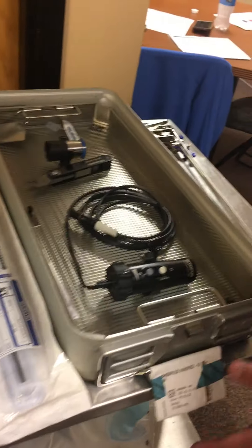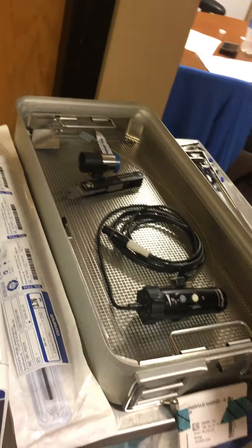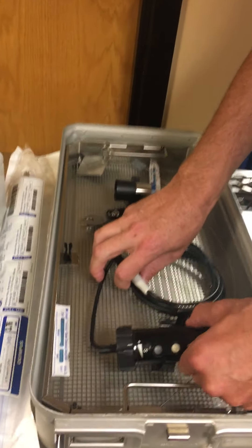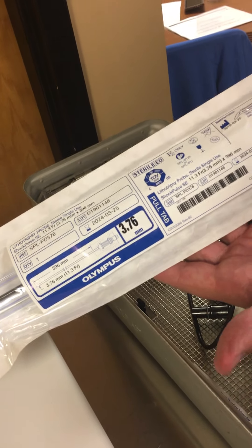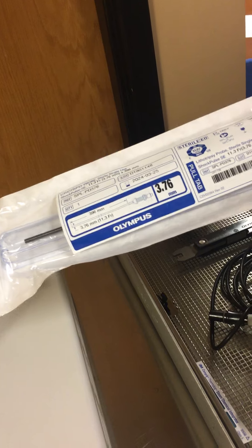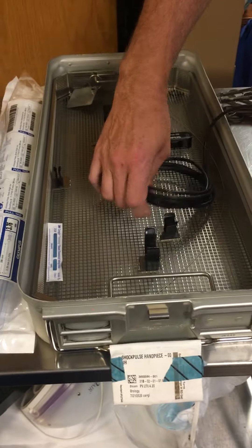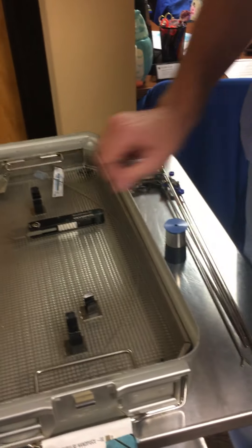Our ShockPulse is ready to use at this point. We'll attach the probe and the transducer. This is our ShockPulse handpiece tray — we have three of these trays. Each tray contains our transducer, our wrench, our nose cone, and then the sterile probe. The ShockPulse probe hangs in the room, and you'll want to have two available — open one but keep a backup in the room.